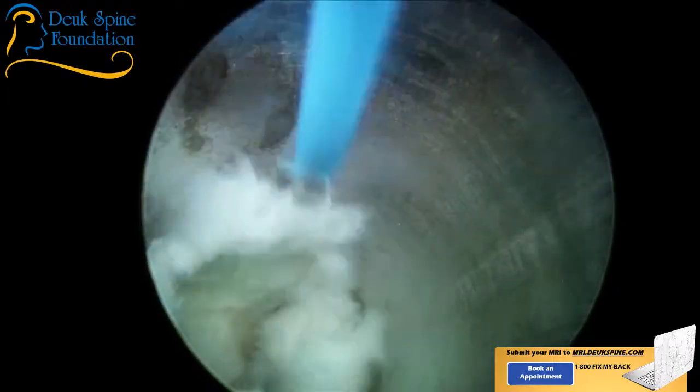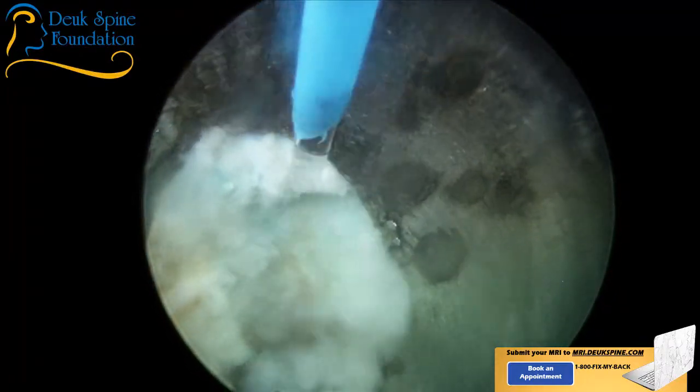Okay, so I'm just cleaning this tear up using the laser.